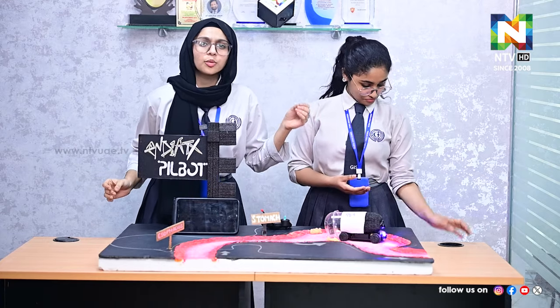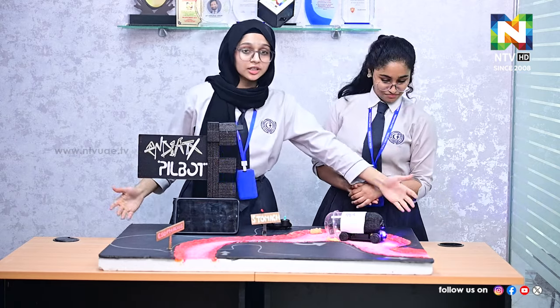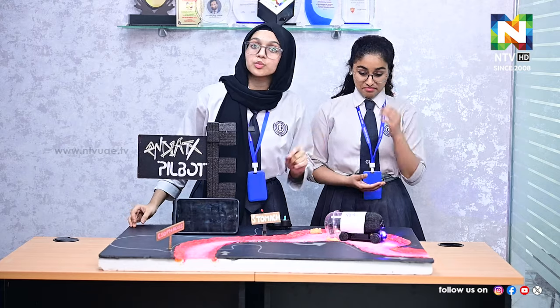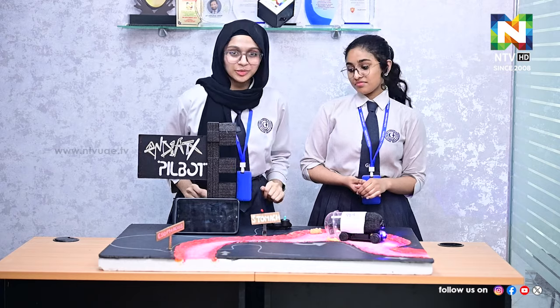Today we'll be launching a brand new project — the PillBot. A PillBot is basically a robot that you can swallow. It helps to do non-invasive endoscopies inside your stomach. What we have here is just a demonstration of how it works inside the stomach, and a real-life PillBot will just be the size of a vitamin pill.